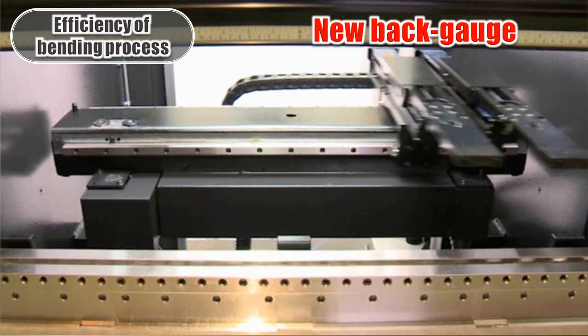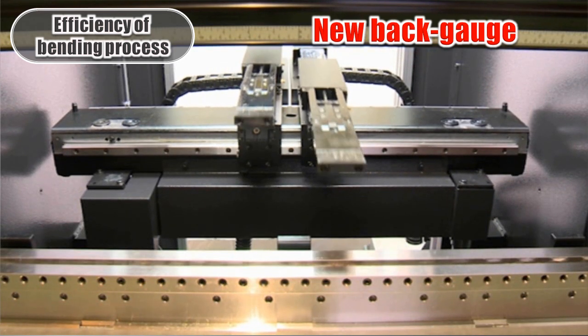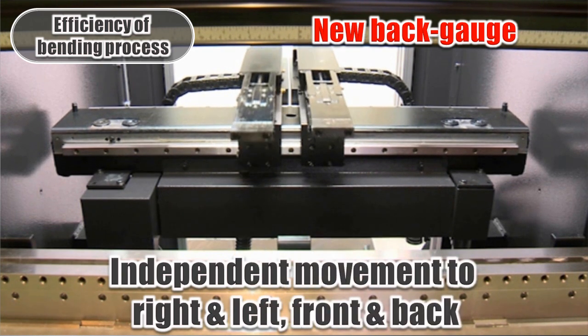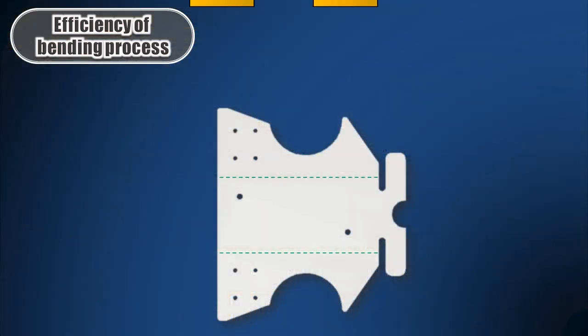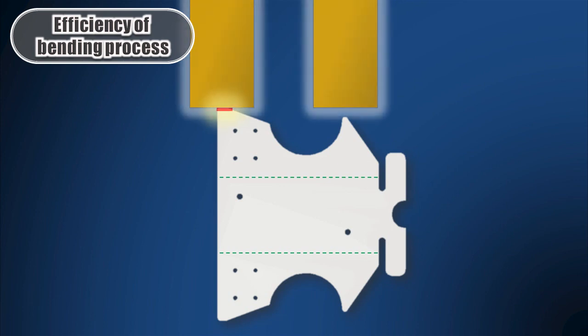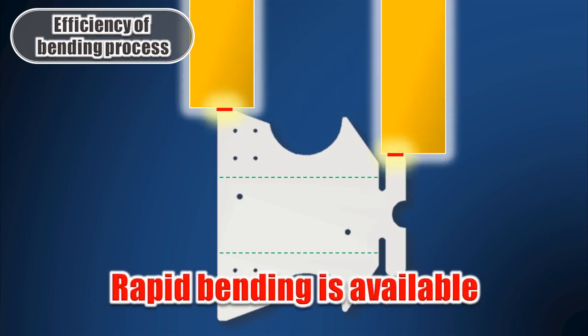The new back gauge comes with independent move to right and left, front and back, which can provide speedy and stable gauging for complicated shapes. Until now, this part could only be gauged at one point, but it can now be gauged stably by 2 points to allow for speedy and easy bend.